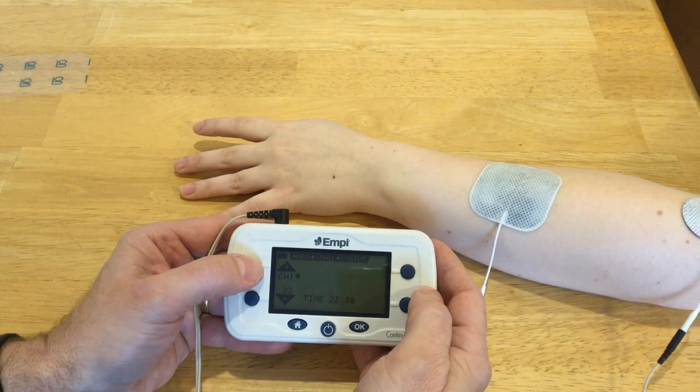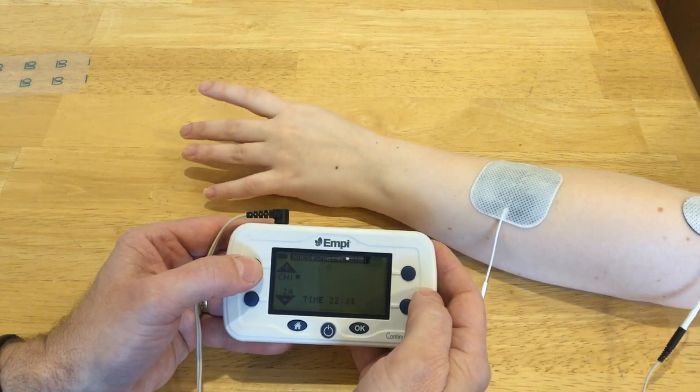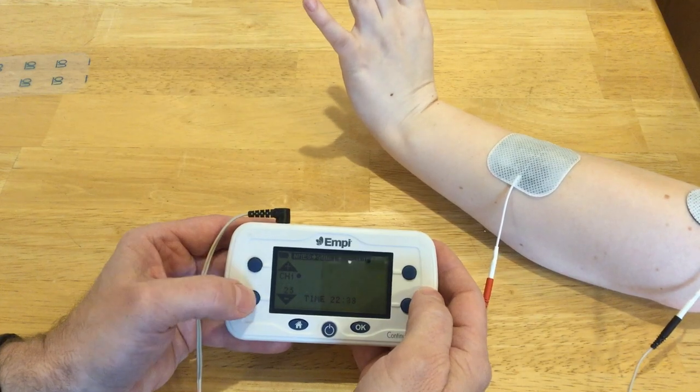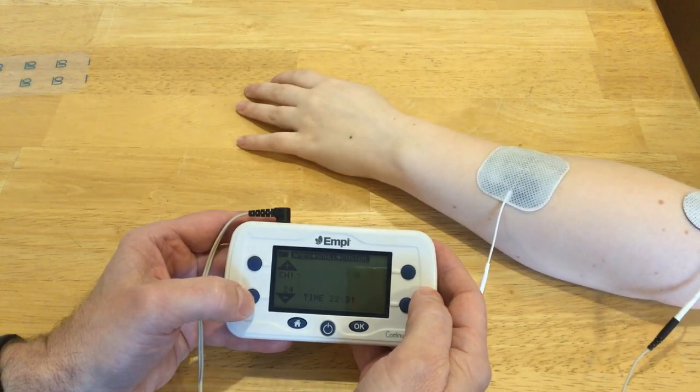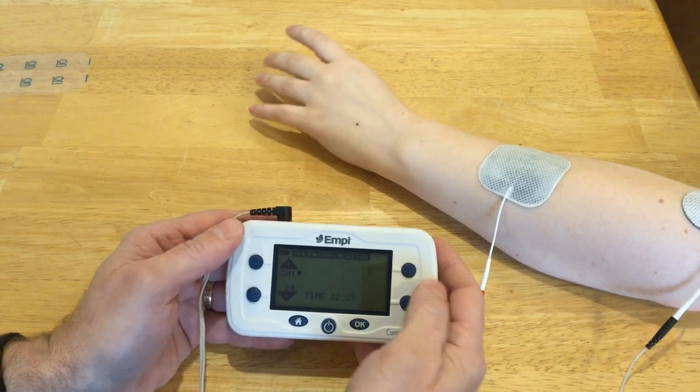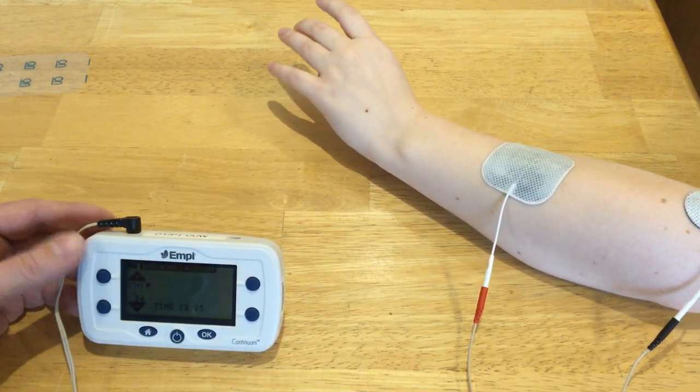We've got extensor indicis, and there we got a really nice radial wrist extensor, but also still getting some extensor digitorum.